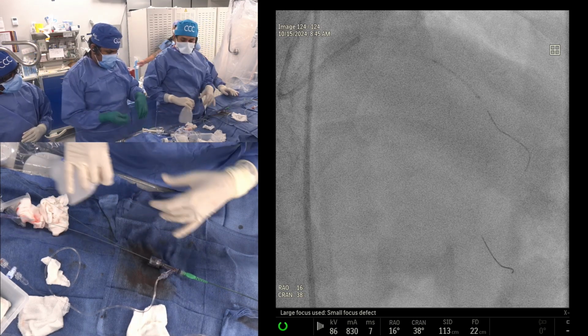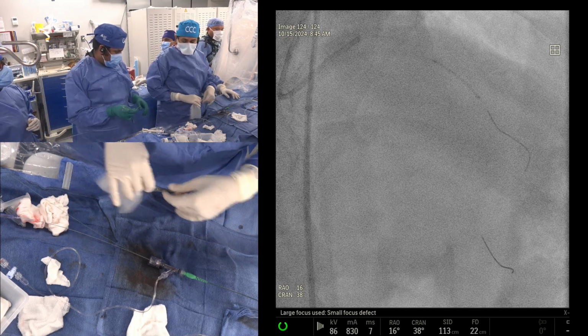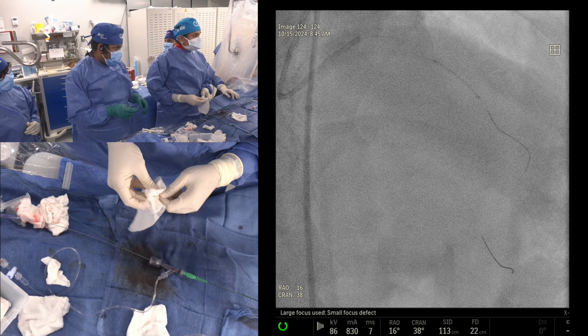Very observant. We have made it. I can tell you the mini crush, only 6 French is only done in some cases.